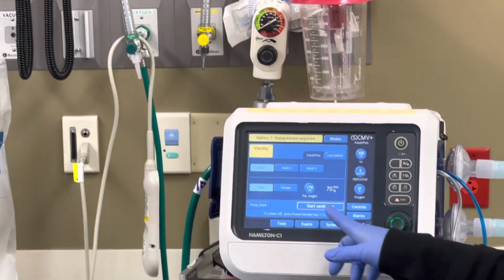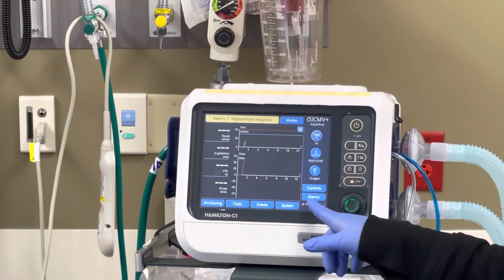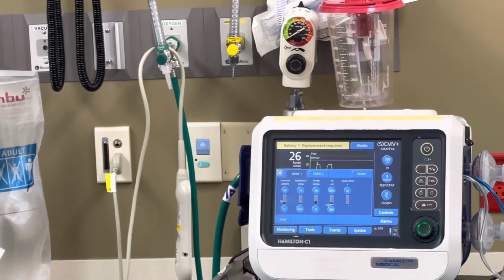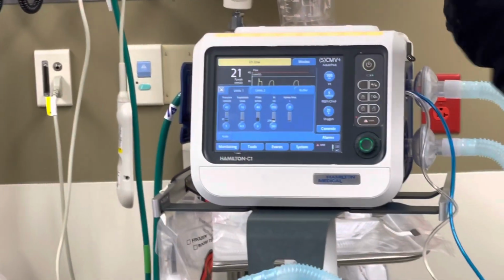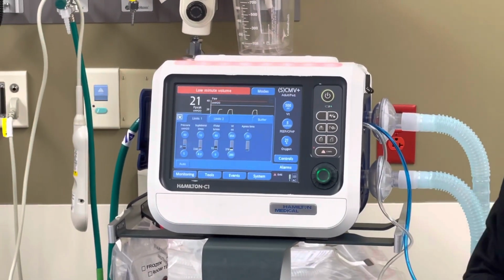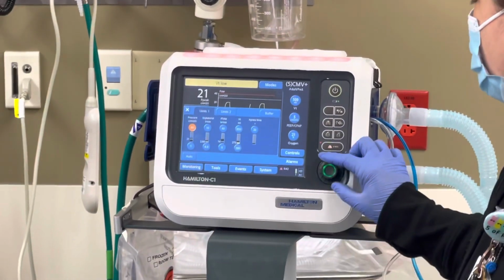So whenever you go to place it on the patient, you're gonna start ventilation. And another thing you're gonna notice is that your alarms are probably gonna go off. On these Hamilton vents, the alarms are set really tight, like really tight. It will not allow your patient to breathe. It will stop them constantly. So what you'll need to do is increase.